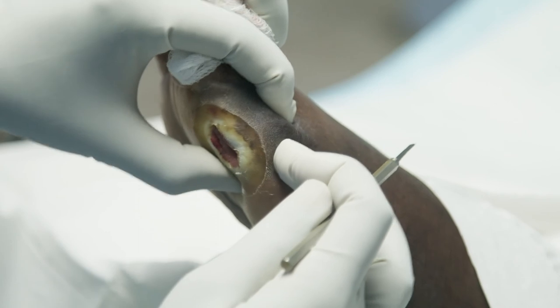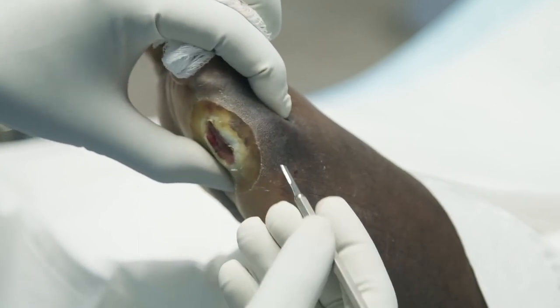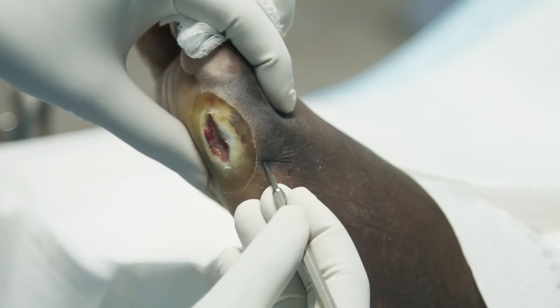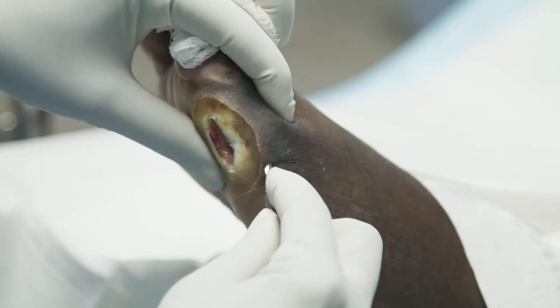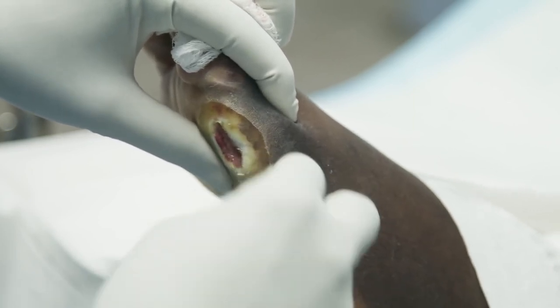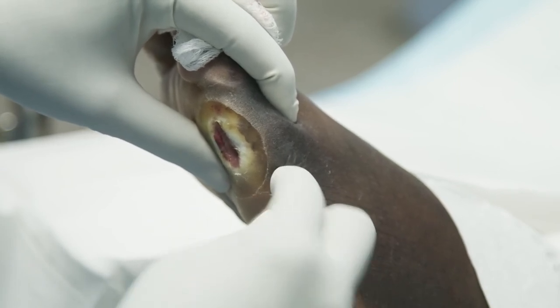And we don't want that. So there we go. Just right on the side there, you see it poking up and bam, I'm in the joint, just like that. Get in the joint, can you hear that? Ding, ding, ding. Boom. Okay, you're in the joint.